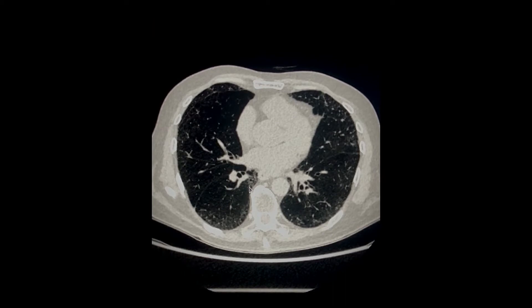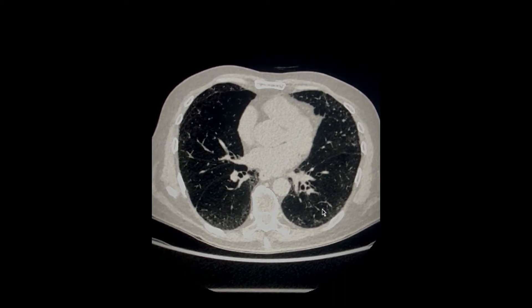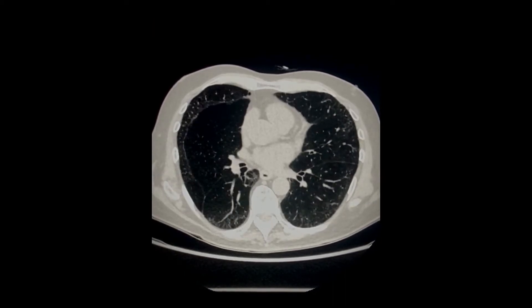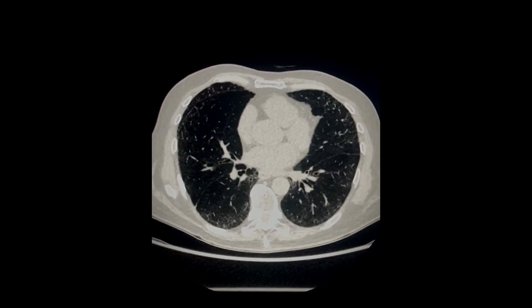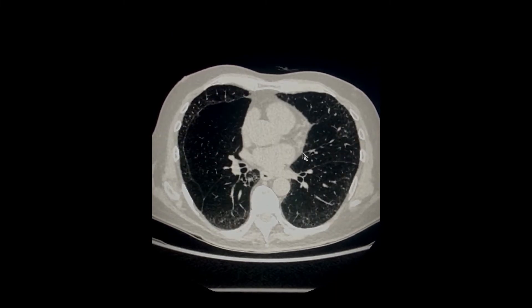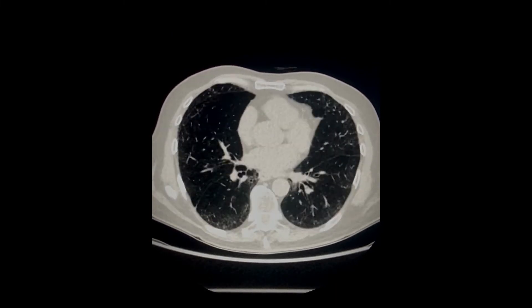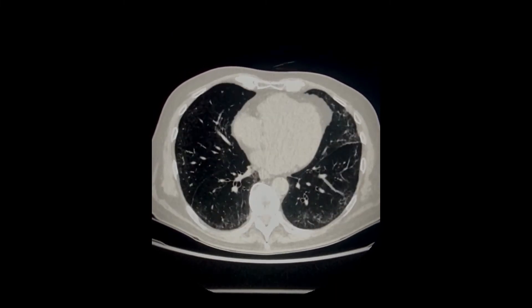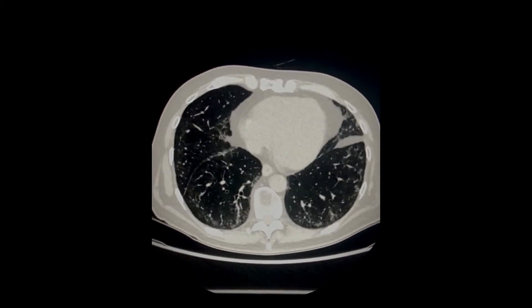You can also look at the azigoesophageal recess and some unusual areas which are not really gravity-dependent, which could also have this feature.